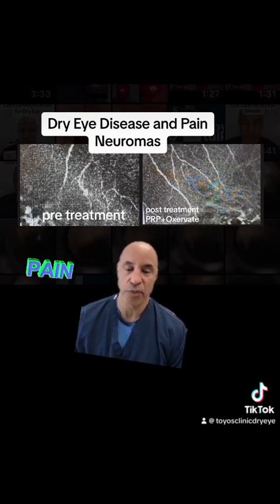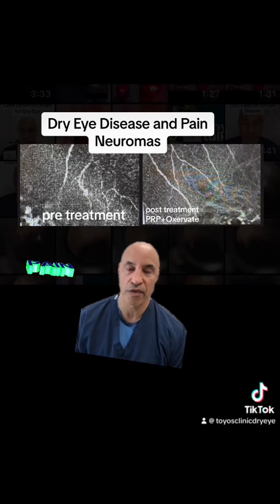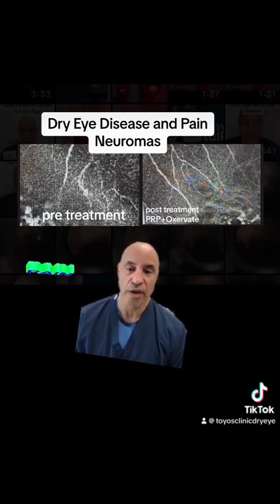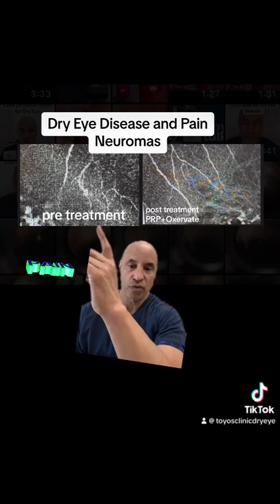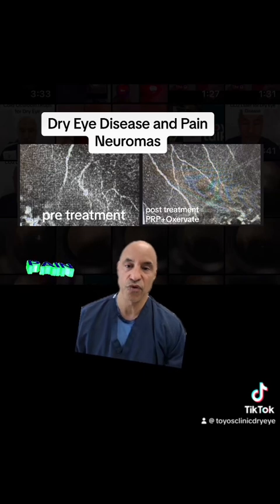This is a typical patient who came in complaining of corneal nerve pain, just overall pain in the eye. We did a corneal confocal, and this one is her pre-treatment corneal confocal. What starts to happen with an inflamed tear is you start to lose your nerves — very few nerves there.